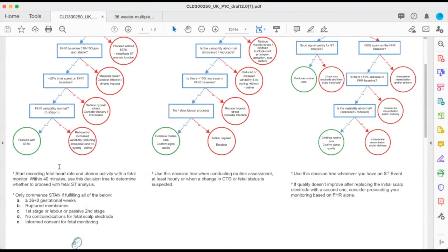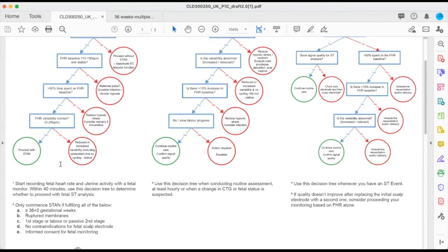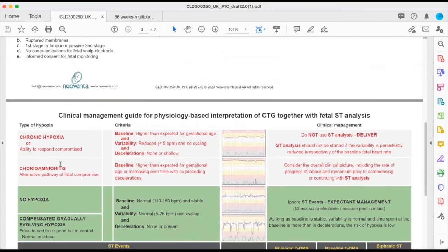I have a question. Yeah. If the CTG STAN was applied when she did not have chorioamnionitis, and then it develops during the stages of labor, and it shows biphasic, can we use biphasic to deliver the baby? You shouldn't use STAN to deliver the baby. If you're seeing subclinical chorioamnionitis as the labor is progressing, you should reconsider how far along the labor is and potentially deliver her. It's not because of the biphasics, it's because of the chorioamnionitis.